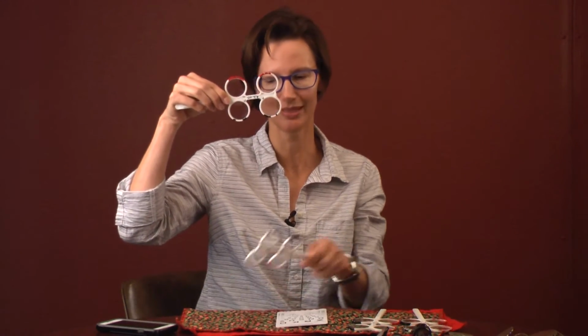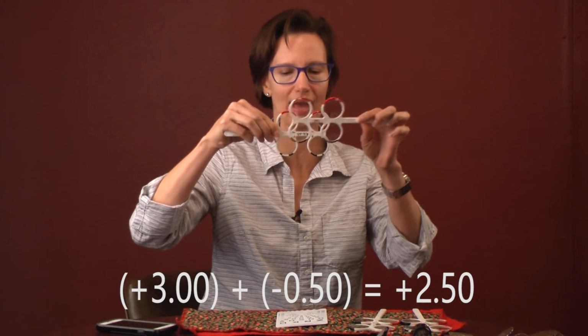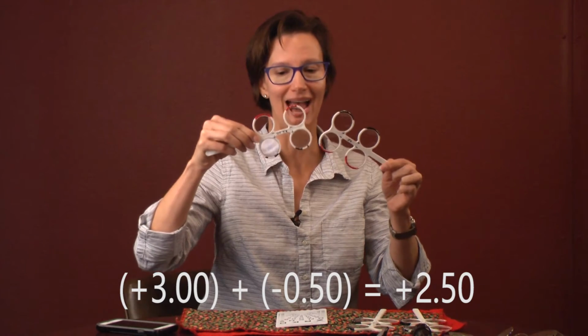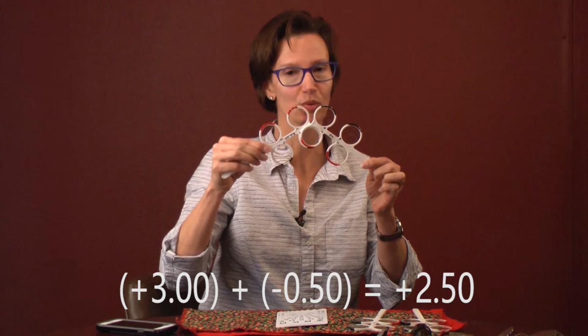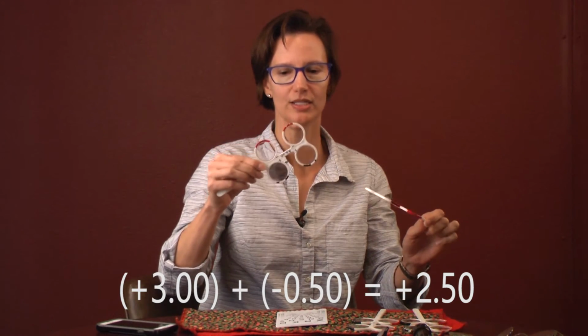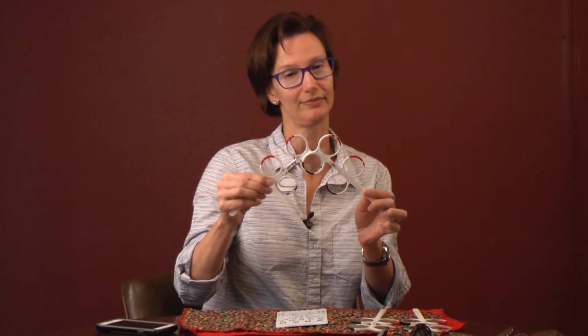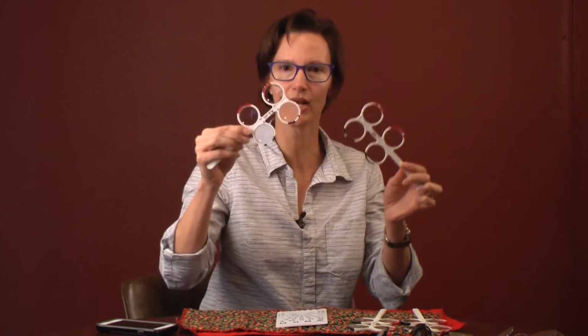So comparing the 5s and the 6, let's back up, and if they like the +3, but the +4 is too strong, same thing we did for the distance. We'll stop there at the 3, but then we'll fine tune it and add the half over it with a negative or the half over it with a positive. So if I add the +3 to a negative 0.5, that gives us a 2.5. You with me? And then plus 3 with the positive 0.5 gives me a 3.5. So that's how we kind of go up and down.